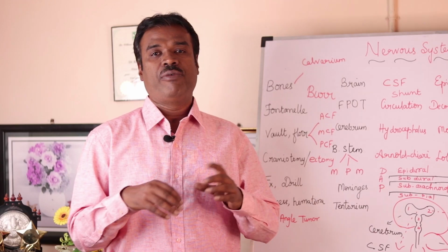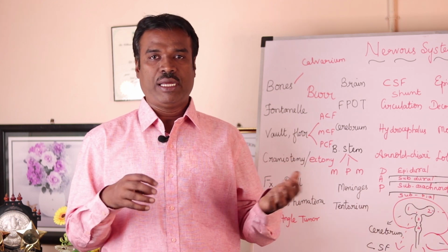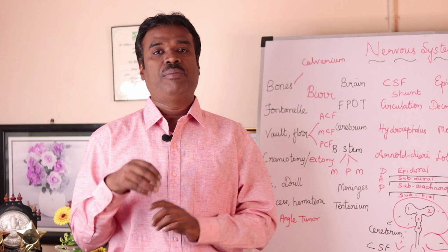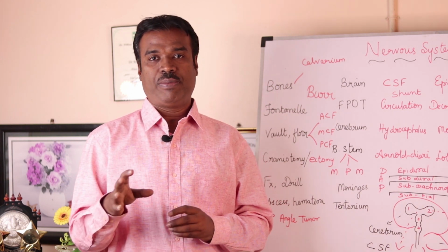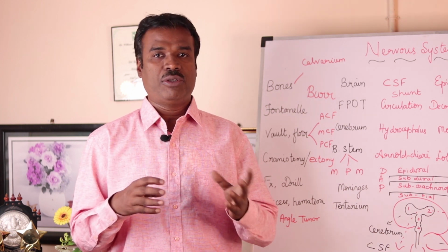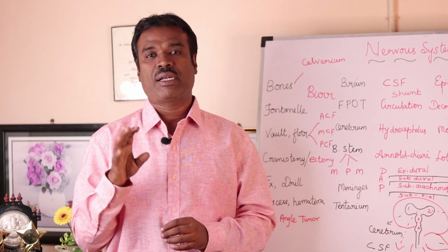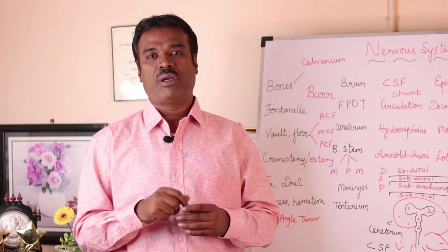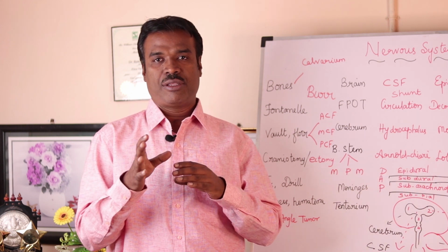The physician will monitor the activity of the brain via these monitoring or depth electrodes, and then in a more radical approach he can also go for a lobectomy of the particular part of the brain where there is excessive activation of the epileptogenic focus. And coming to SRS, which is stereotactic radiosurgery, here what happens is precise localization of these targets.